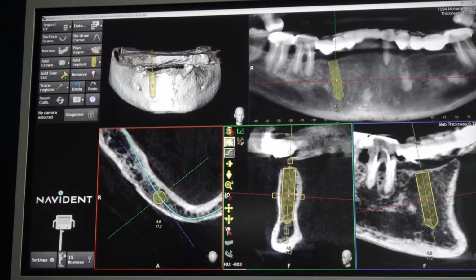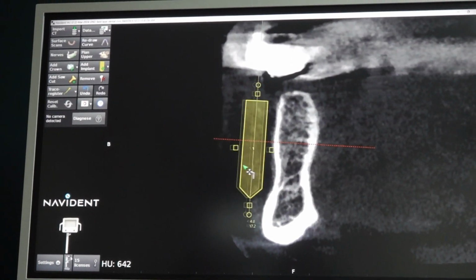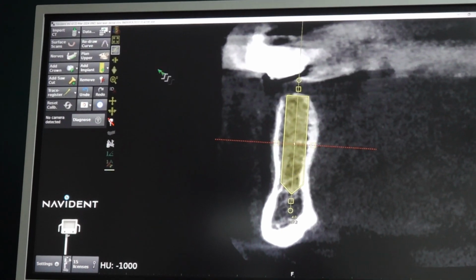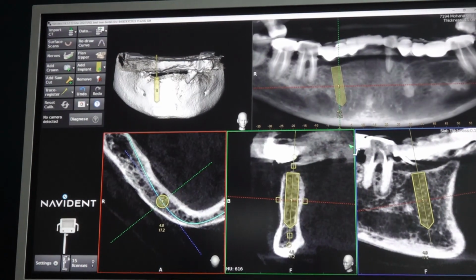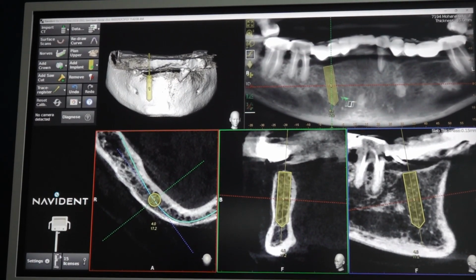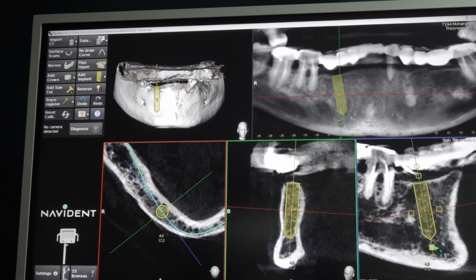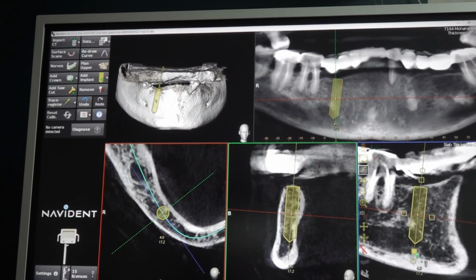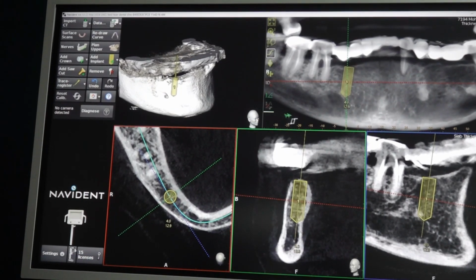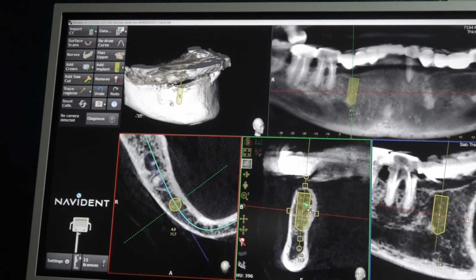Why? Because the abutment will go. If you tilt, you have to bend it. The bone is very soft, so you cannot bend. The implant will move through the bone. Bending won't happen. So better choose a shorter implant. Anyhow, we will be doing alveoloplasty here, right? So we will be using a very short implant, maybe a 10 mm implant.